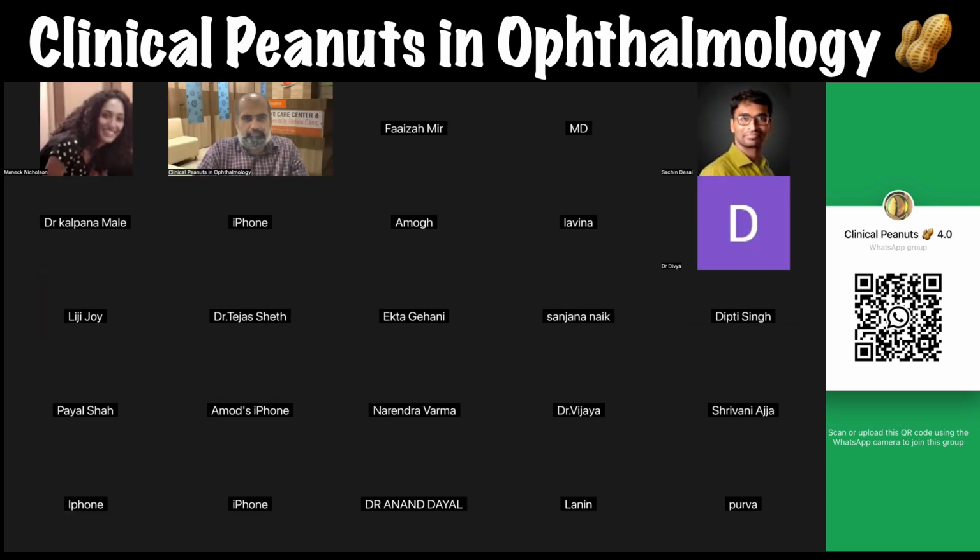If you have the pre-op readings, the post-op readings, your final refractive error, how much your cylinder has changed by, and the size of your error, and you can enter all that in, it's absolutely fantastic to do. But I don't think you need to calculate your SIA before you start toric lenses. It's definitely recommended, but it's not a prerequisite to start doing toric lenses.